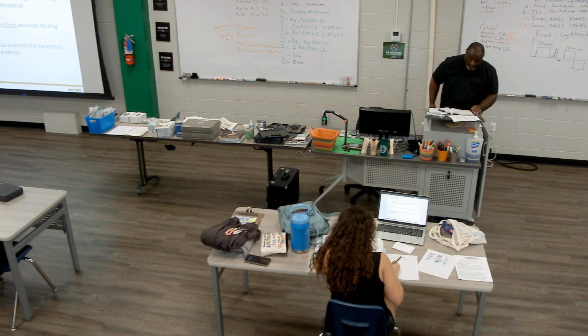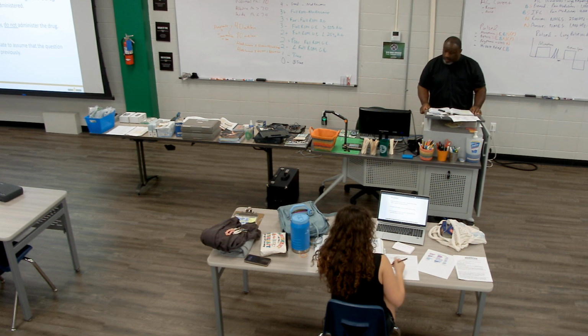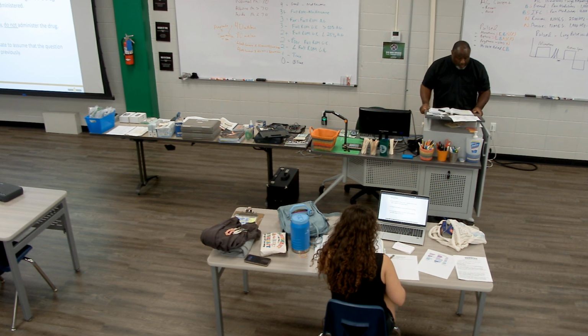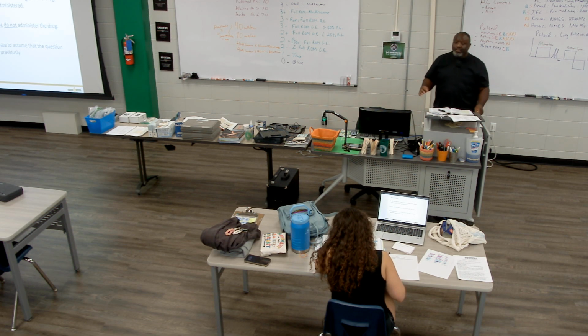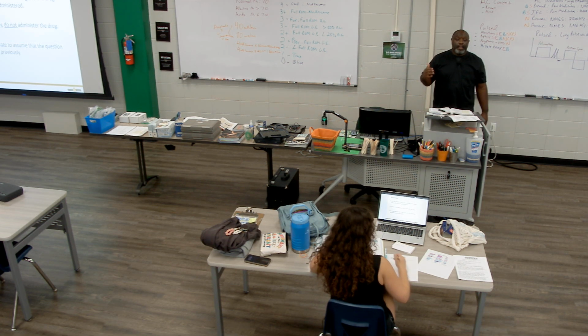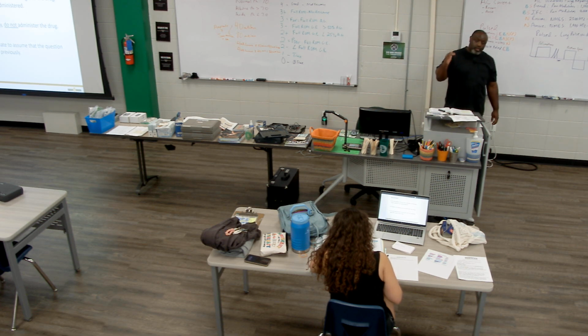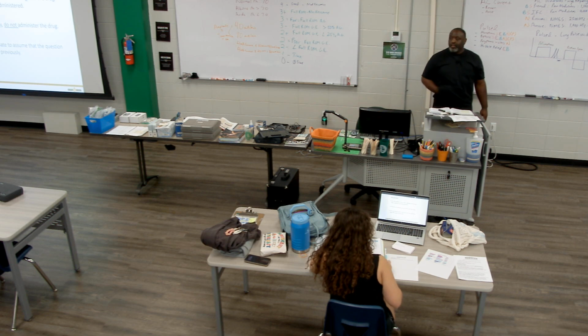So, last couple of parts here, getting into these application guidelines, page 300. Okay? Application guidelines. First thing it says, the clinician should determine the treatment area and the size of the drug delivery electrode. This is not meant for large areas. It's not meant for deep areas. It's not meant for things that are covered by a lot of adipose tissue. You want to do iontophoresis over something very superficial. You don't want anything with great depth. If it has great depth, find another methodology.